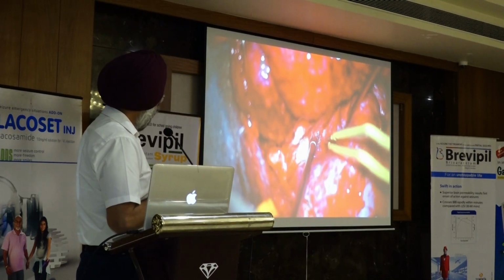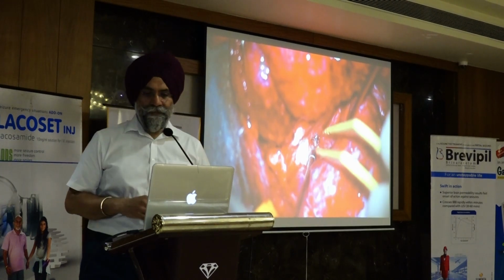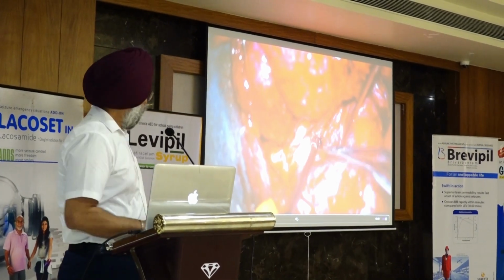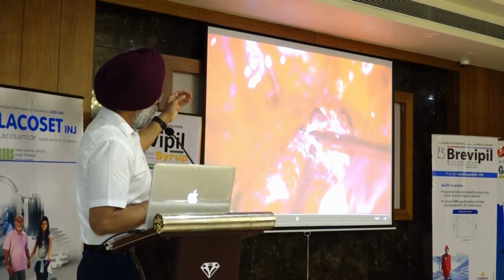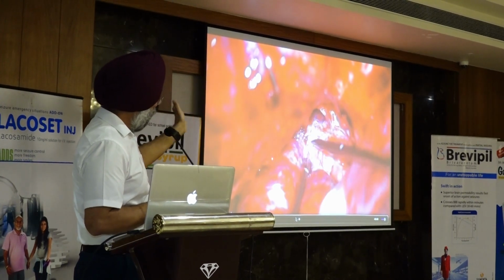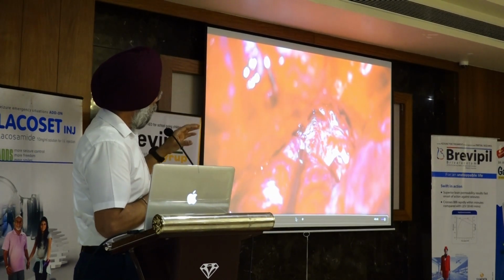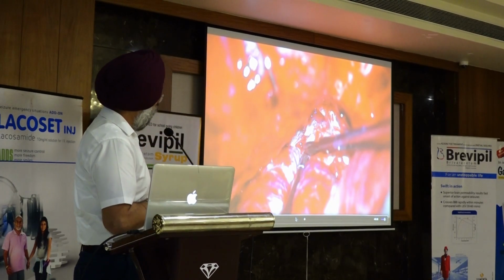We are now coagulating and cutting. After cutting the middle meningeal artery, now you have to develop a plane. Usually I start anteriorly with the orbital periorbita and the dura, because they are joining and there is always a groove there. You just have to do a sharp dissection from there, and there is a very good plane of cleavage. You have to develop that plane and keep on dissecting posteriorly.